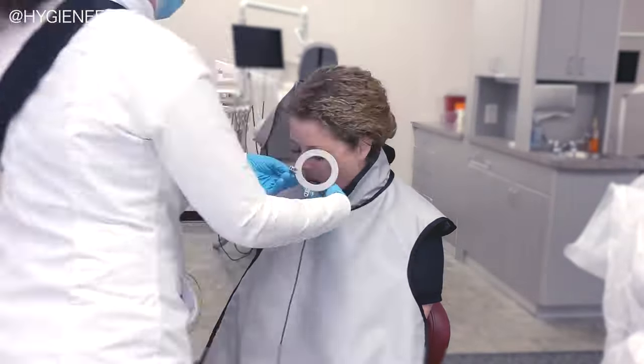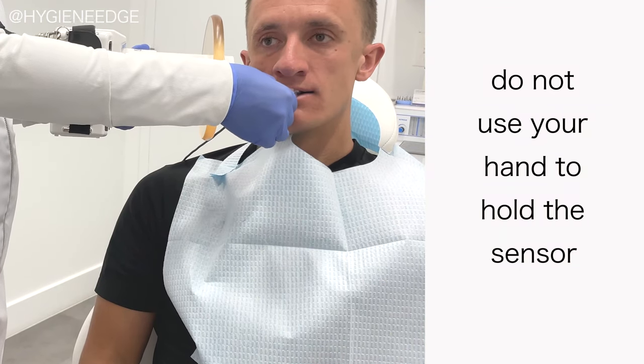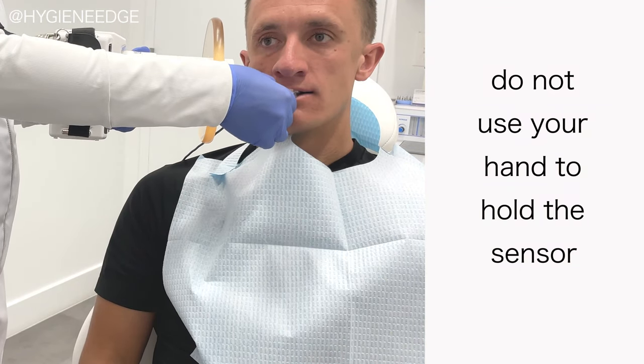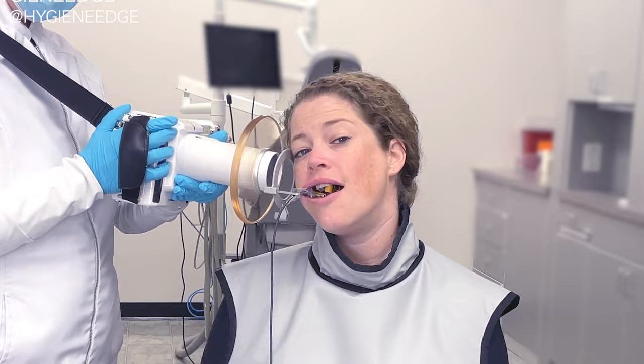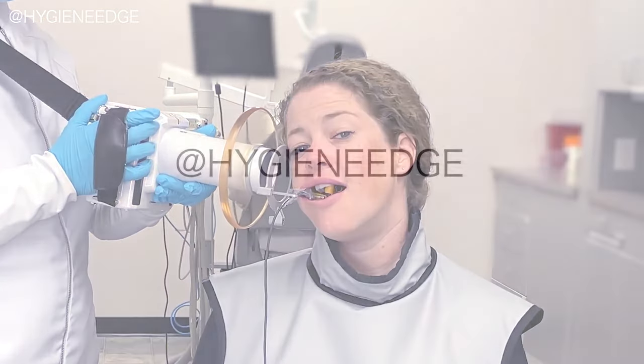It's tempting, but don't ever use your hand to hold the sensor during exposure. Your hand will be in the direct beam and outside of the safe zone. Handheld units have been studied and are safe in a dental setting. If you use them with proper positioning, there's no radiation exposure.